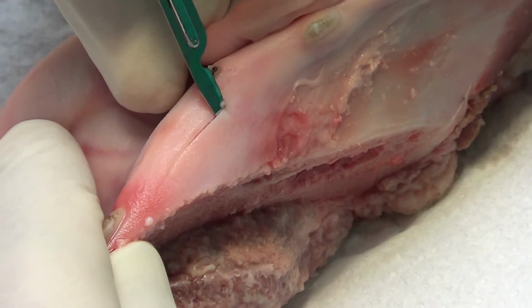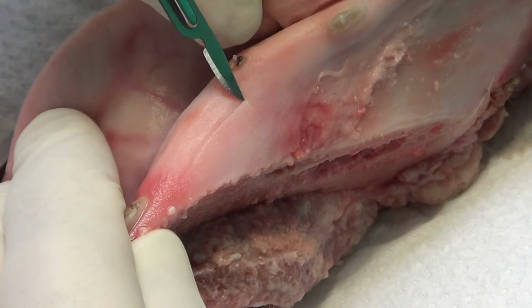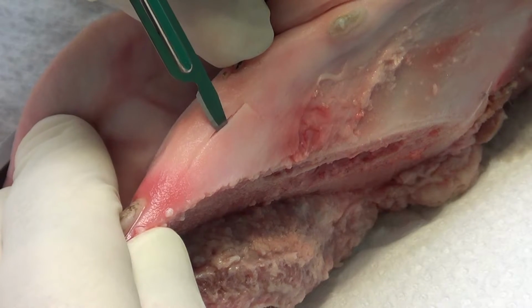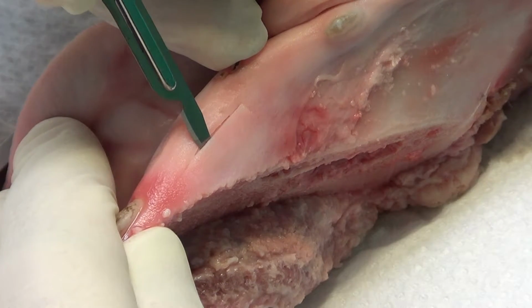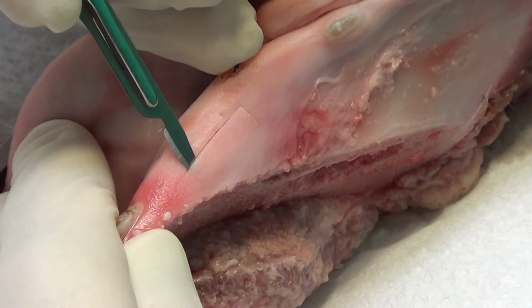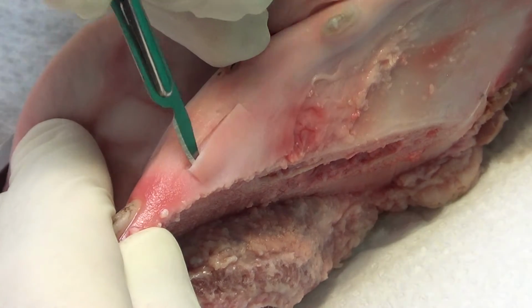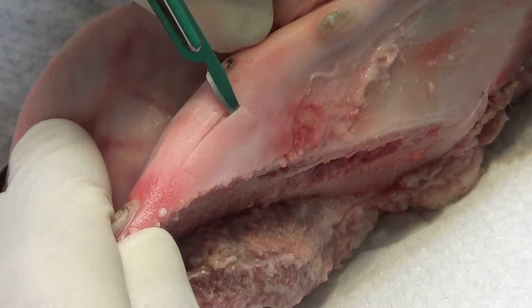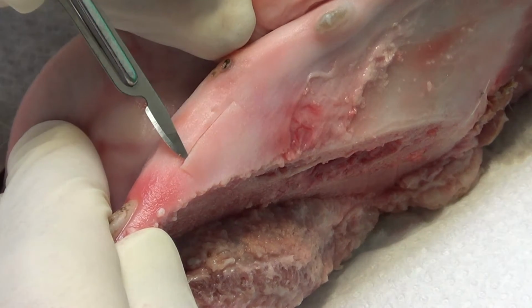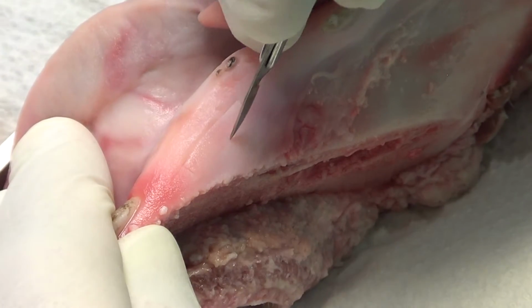You arrive at the end, and then you can do it in the opposite direction. The most important thing is to arrive with the end of the blade at the length of the vertical incision. You have to be here, because if you stay a little bit shorter, then you are not able to remove it.